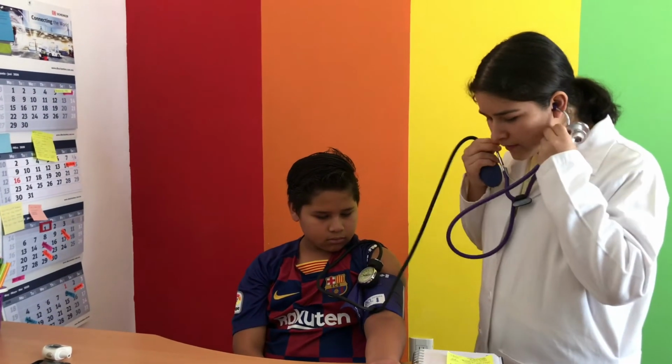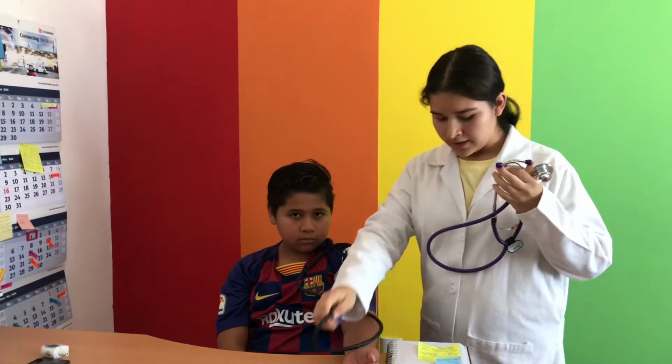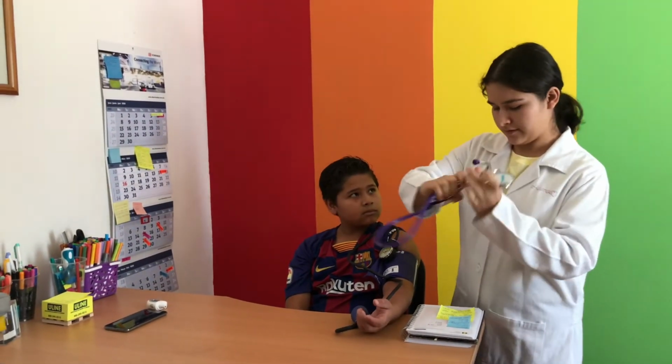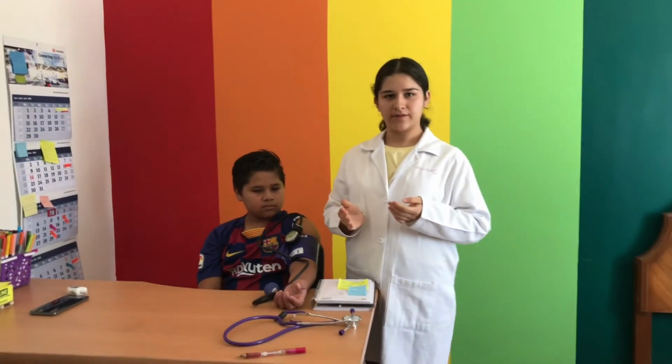Okay. So he has a blood pressure of 104/80. And we'll be moving on to the next measurements.